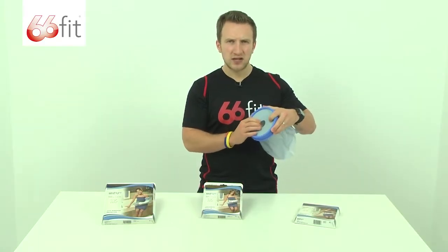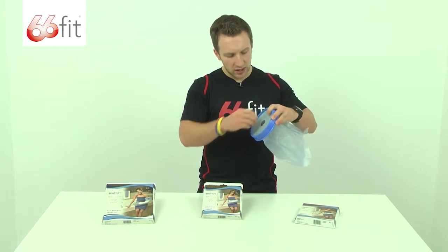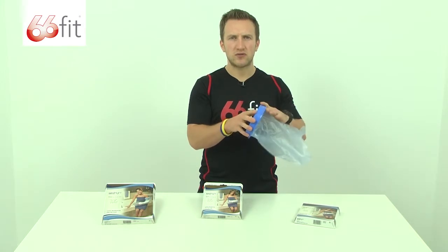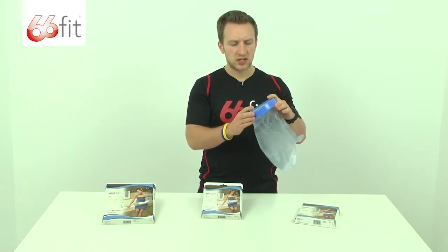This is latex free, so you don't need to worry about it irritating you, and then this is going to close up around your wrist and form that waterproof seal, so obviously whilst you are in the bath or the shower, your bandage doesn't get wet.